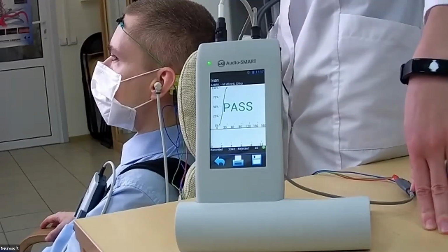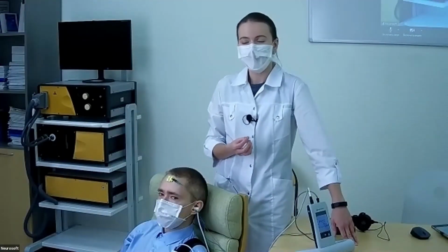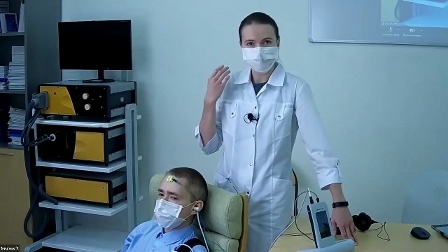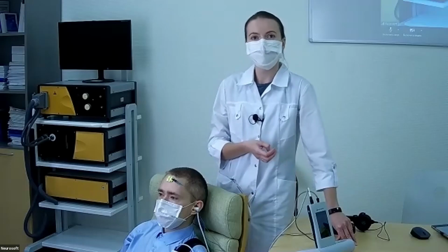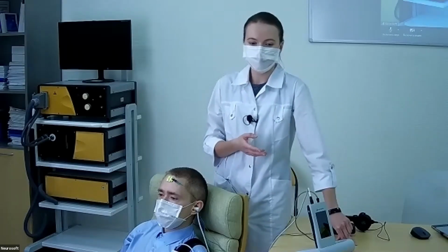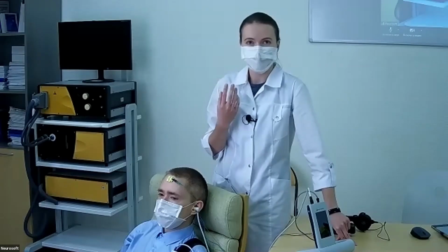The state of the cochlea you will evaluate with the help of otoacoustic emission tests. And if you suspect that the lesion is back from the cochlea, you should perform an automatic ABR test to detect the state of the retrocochlear part, especially the auditory nerve and the brainstem.